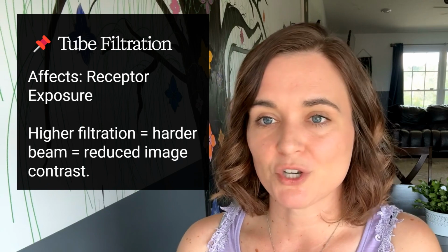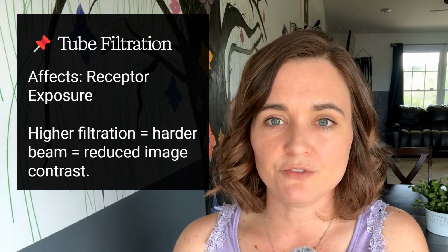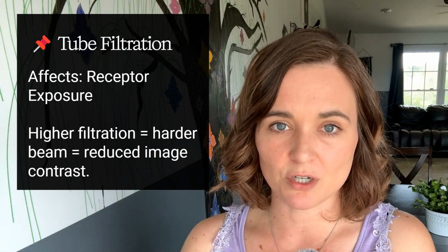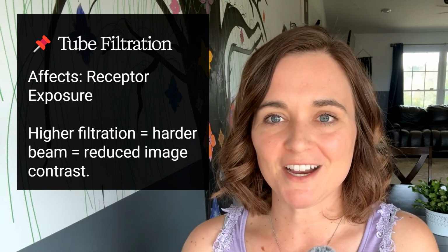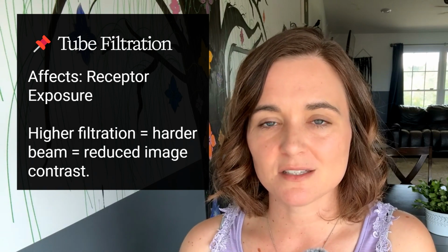Next up is our tube filtration. This affects our receptor exposure. It filters out low energy photons, reducing patient dose, but also reducing exposure. Here's a tip. The higher the filtration, the harder the beam, and the reduced image contrast.